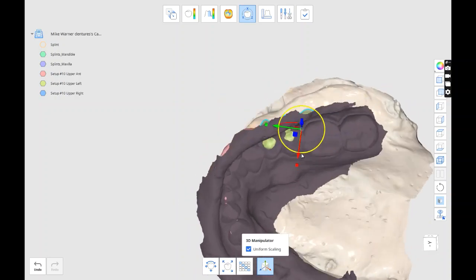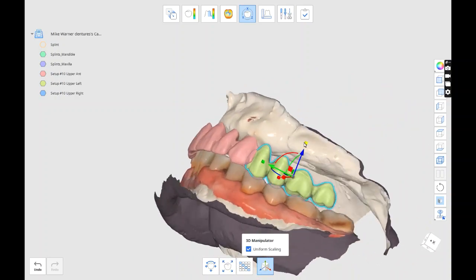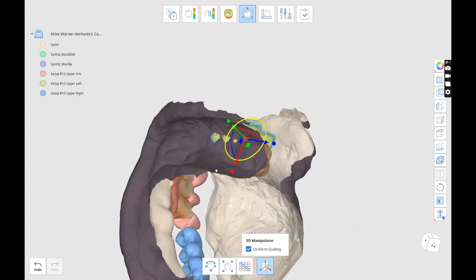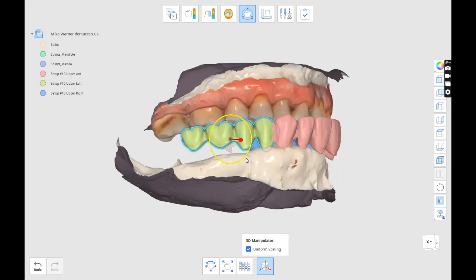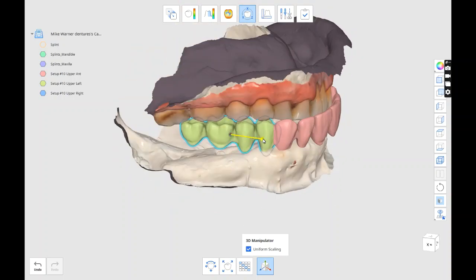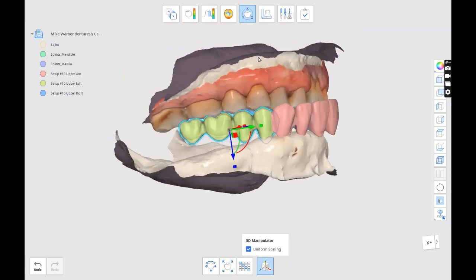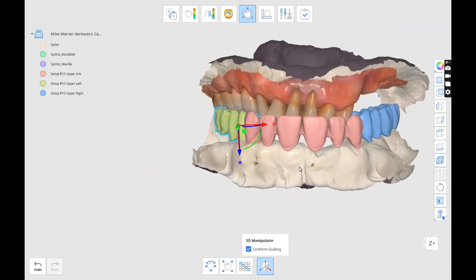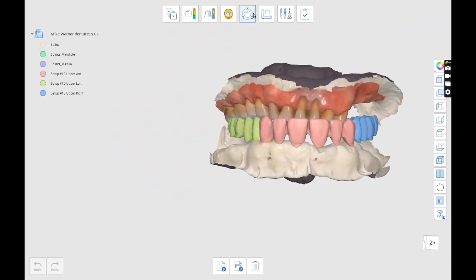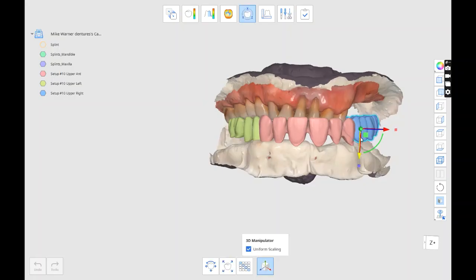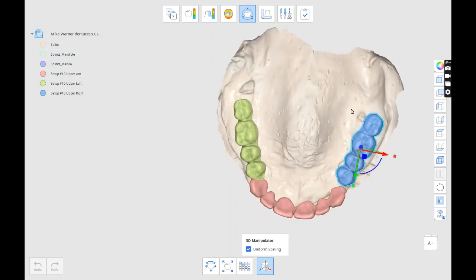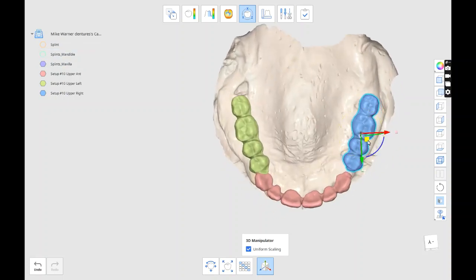I mean, this is for an immediate, so when I do this I'll let it heal. Then I'll use this denture actually to take an impression, or I'll print it up in a cheaper material, and you take an impression with it in the mouth and I'll send it to the lab to have it remade when the healing's done.